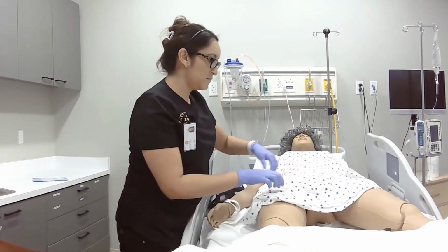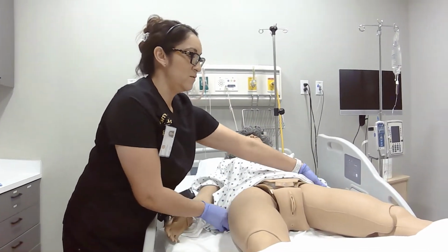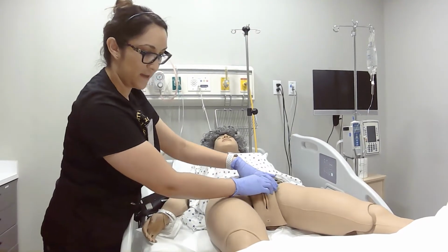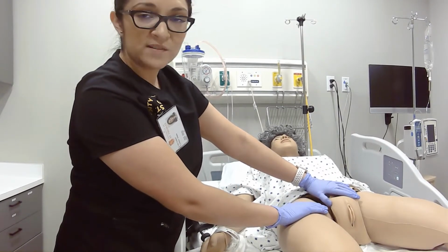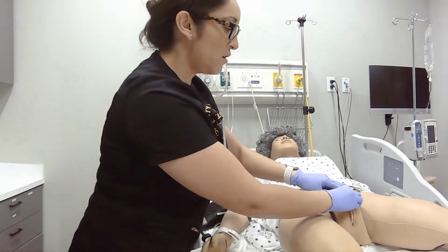Alright, Miss Adams, I'm just going to pull your gown up just a bit, okay? And just expose what you need. Don't put the gown back all the way, okay? So, we're going to start off with the female insertion. That is more complicated than the male.